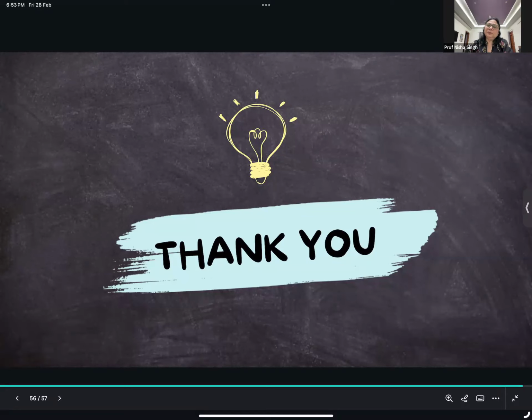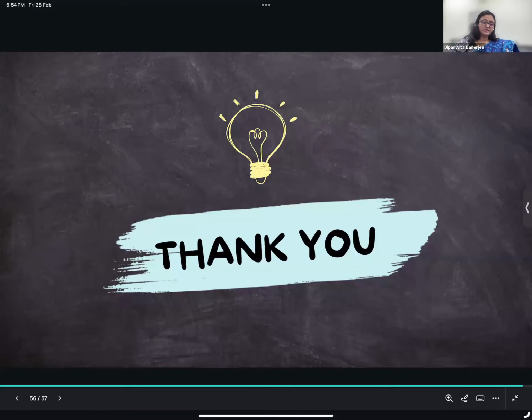If you follow the IFCPC colpo terminology, apply it for all the colposcopies, maybe 1 or 2 you are doing in a week, but take a printout, make a point that you are ticking all the points, and then do the Swede score.